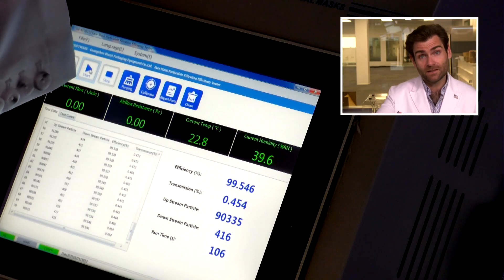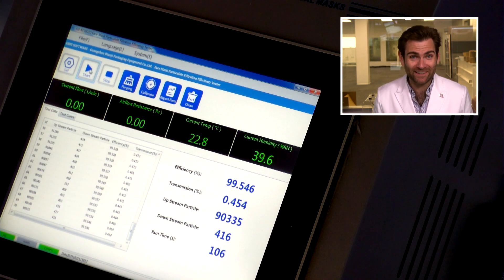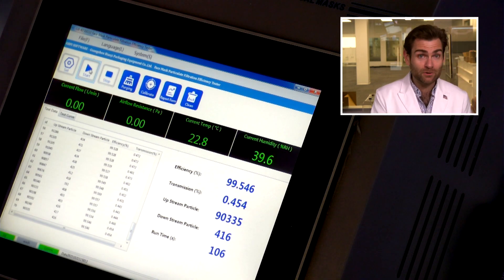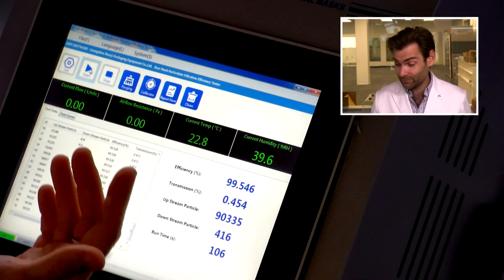Remember, this is an FDA-cleared mask — it needs to do 98% or better on this machine. And there it is. Faith has been restored in humanity. We had so many masks failing before, I was starting to wonder if I was going crazy or if my machine was broken. I stopped to recalibrate it a couple times just to make sure. That's a good quality mask. You can't buy it on Amazon, but if you find the Flu Care mask anywhere, you can probably trust that company — it seems like they do a pretty good job.